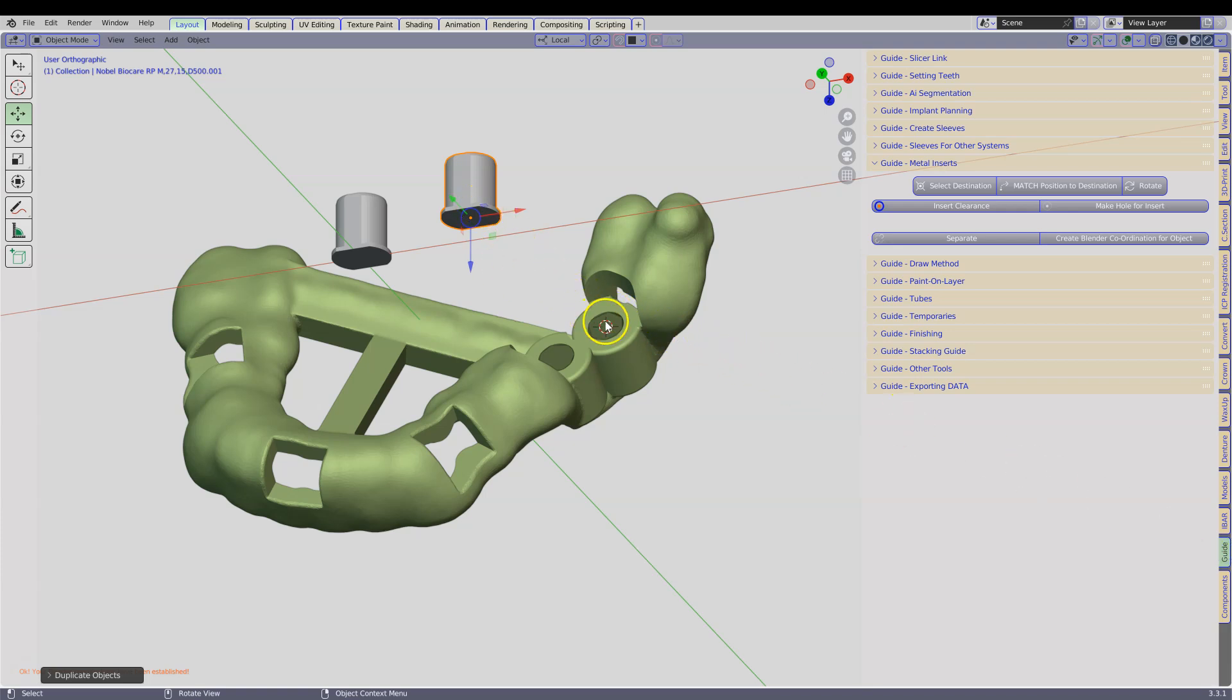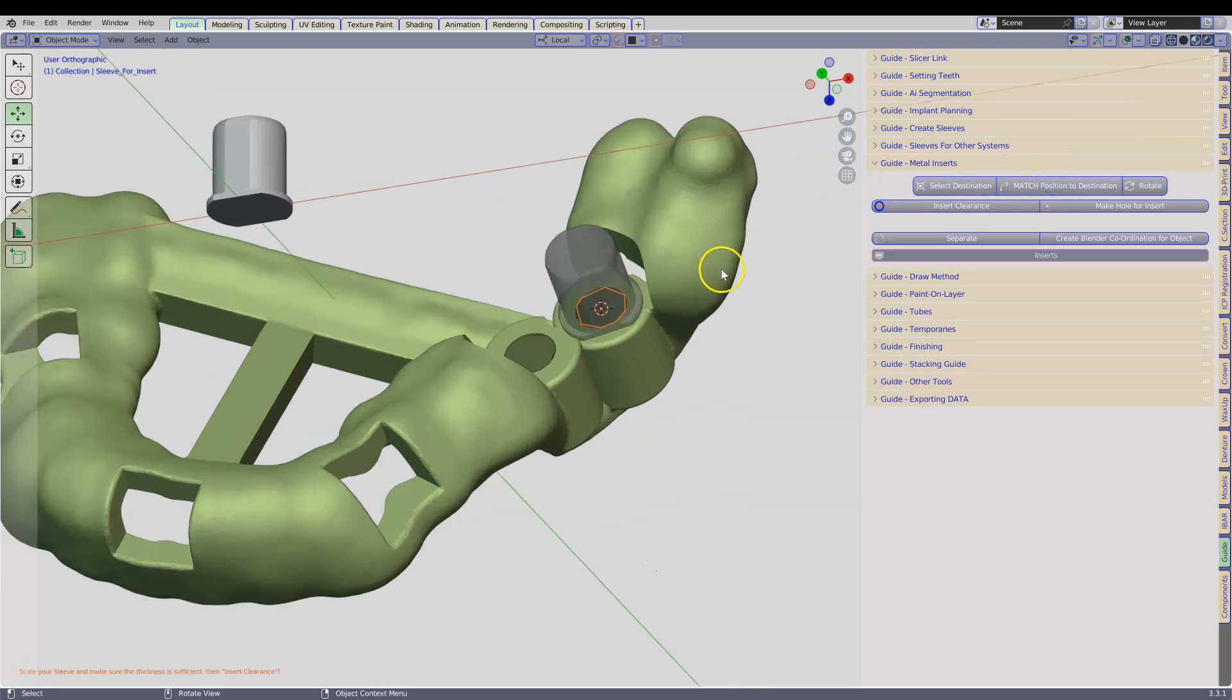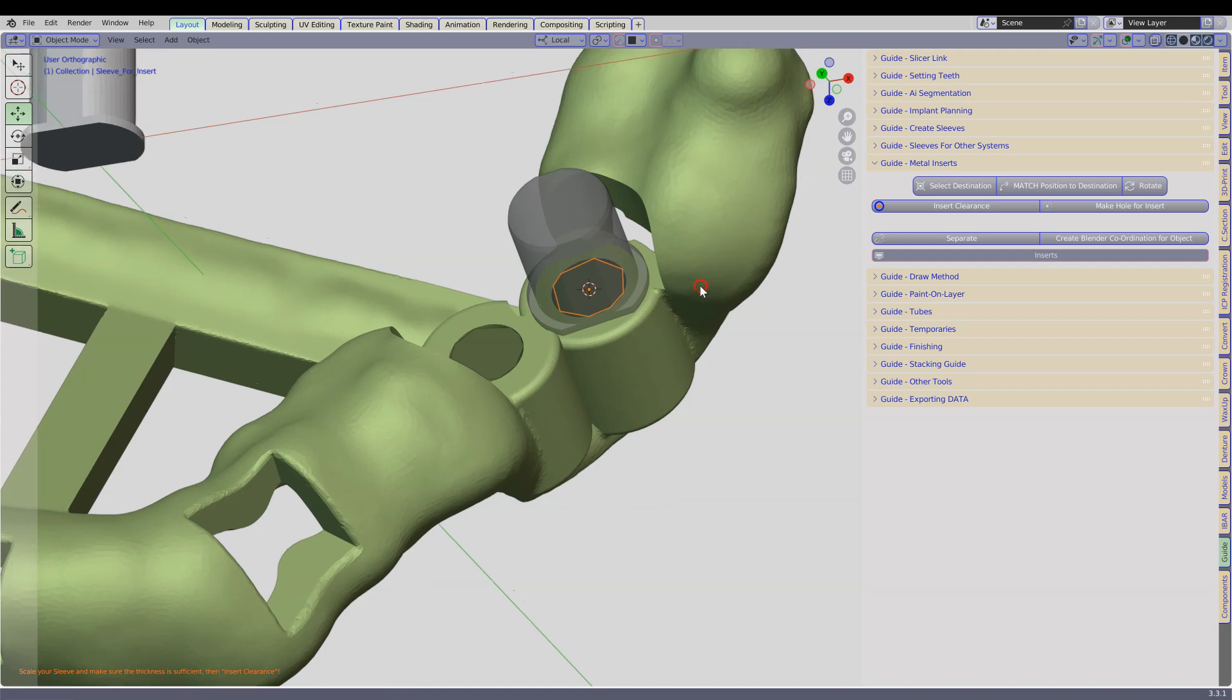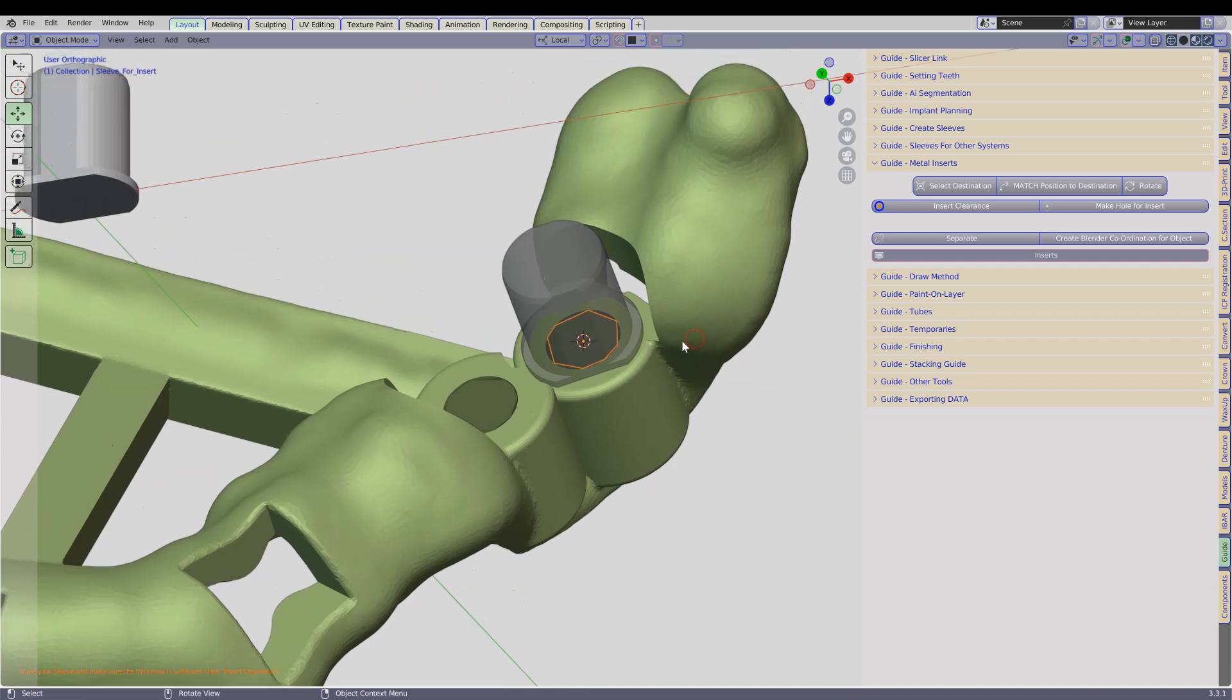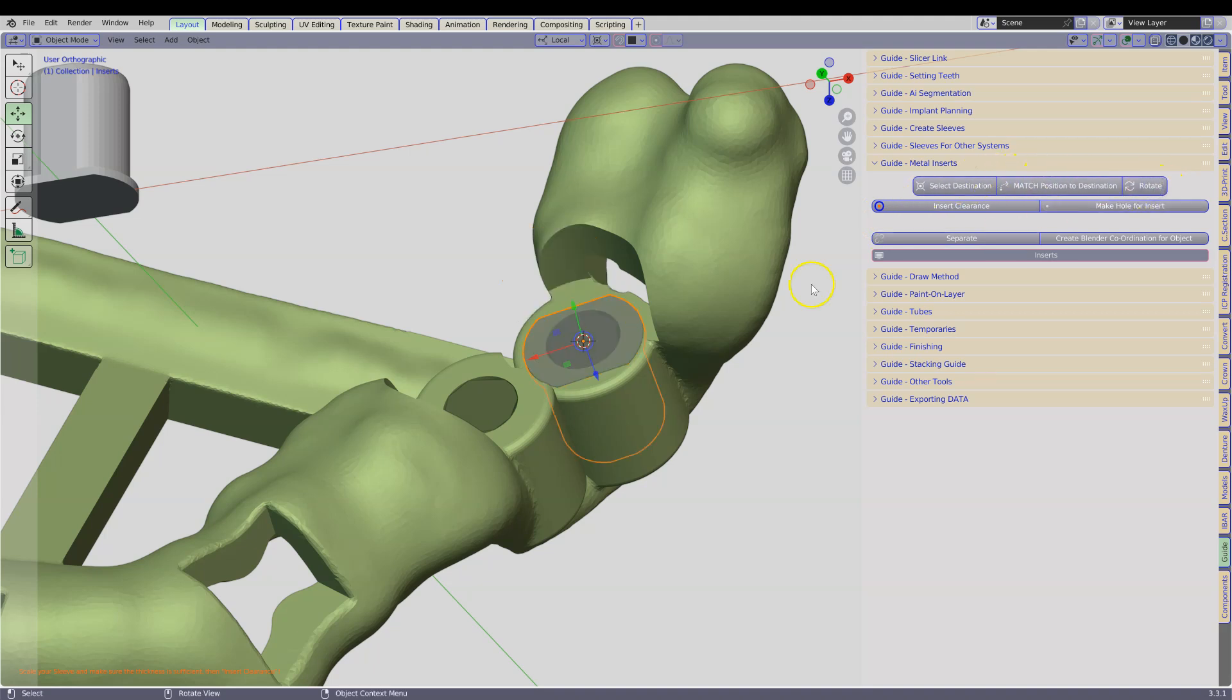And then this one becomes our destination, and this becomes match position to destination. Note how this one is incorrect. This is because the normal was facing in the incorrect direction.